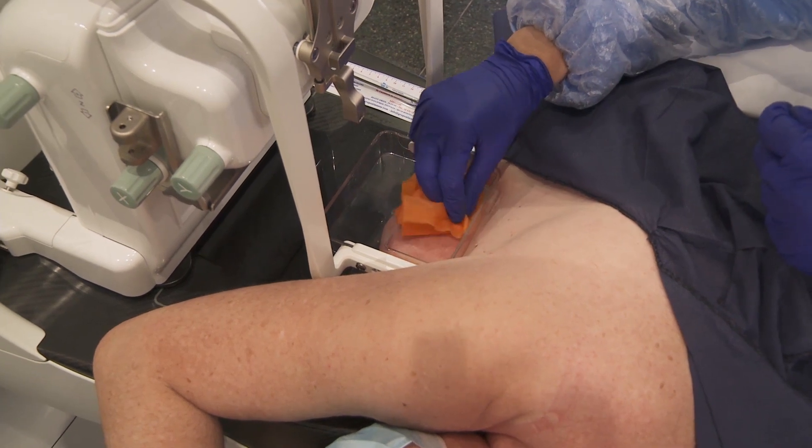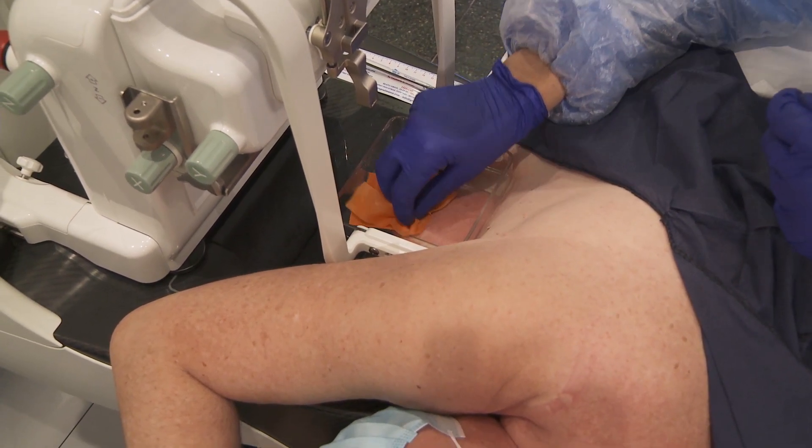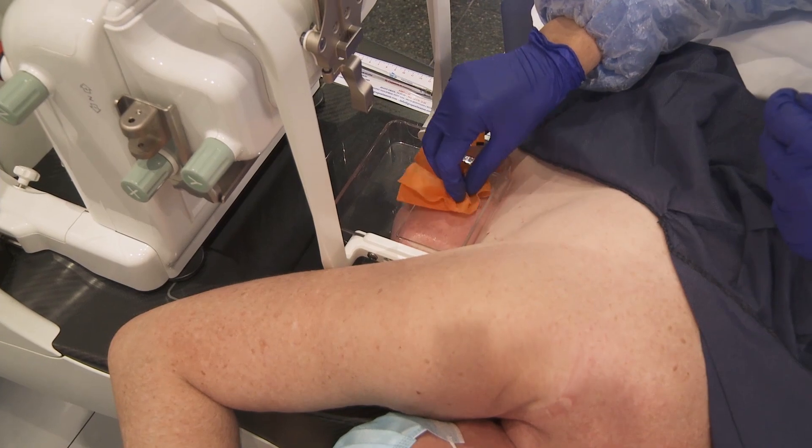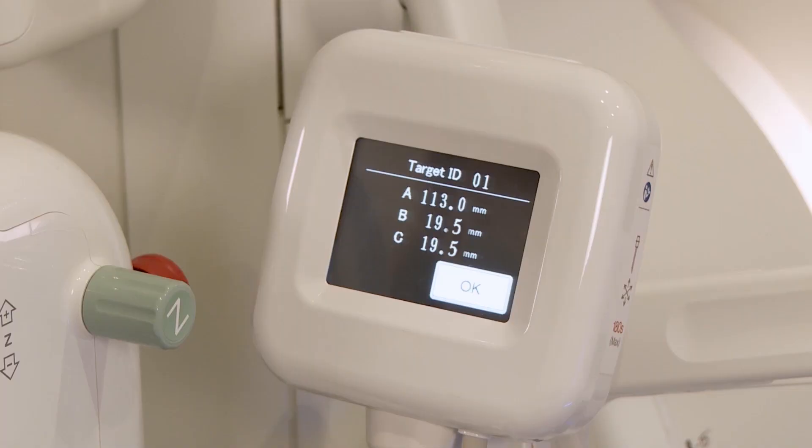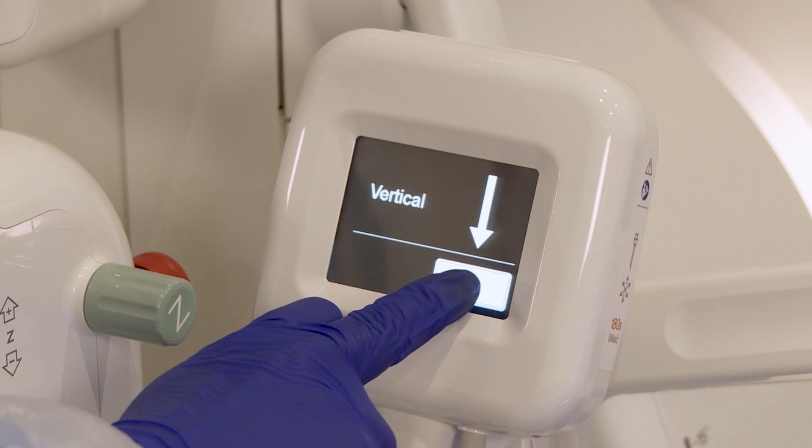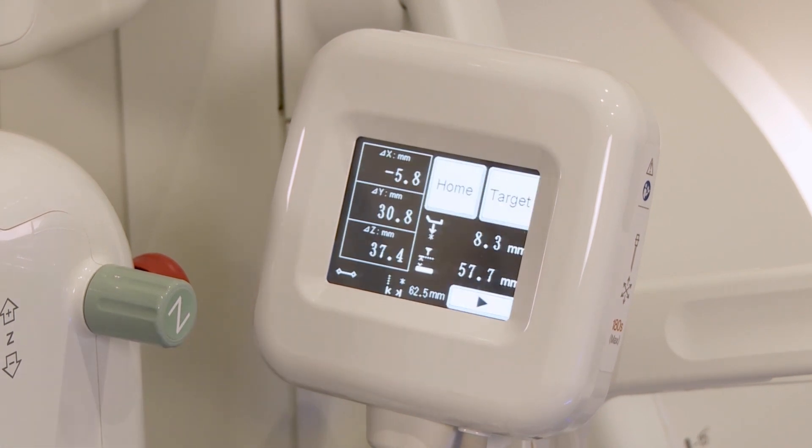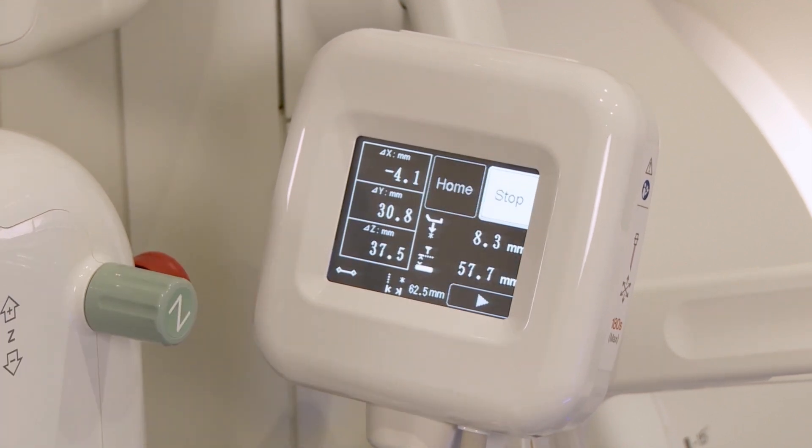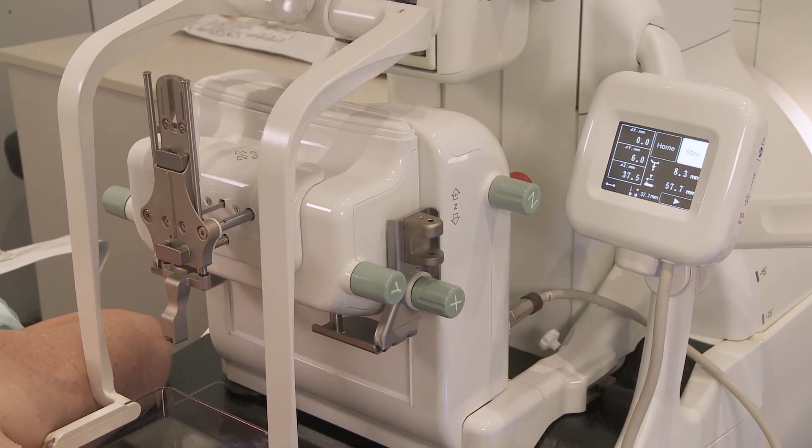Proceed with skin disinfection. The operation panel shows the target ID and needle characteristics. Press OK to confirm. Press OK to confirm vertical approach. The target information is displayed. Press the target button to drive the needle holder to the selected target coordinates.